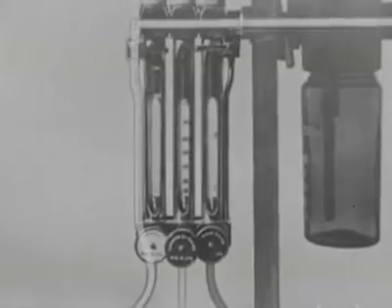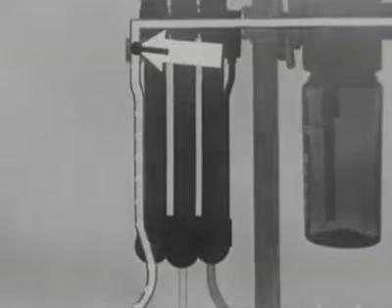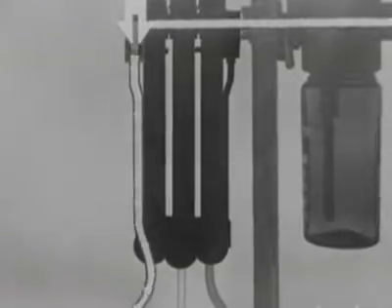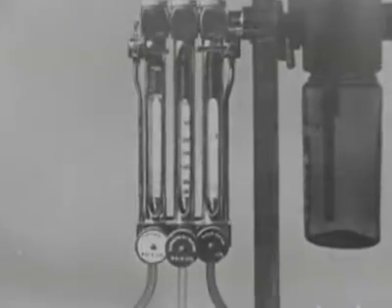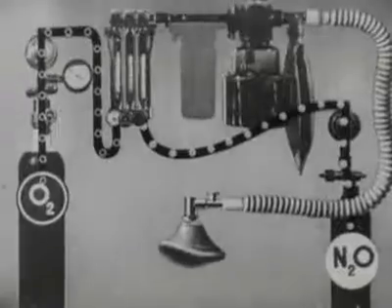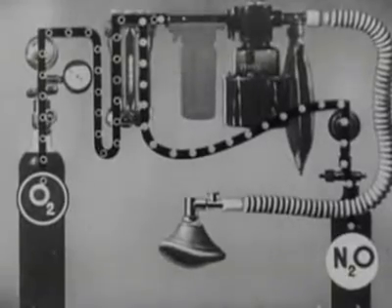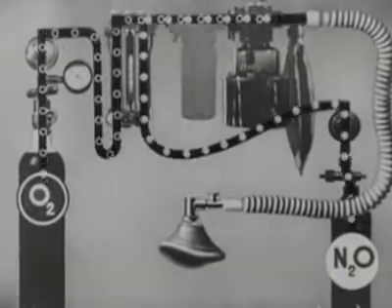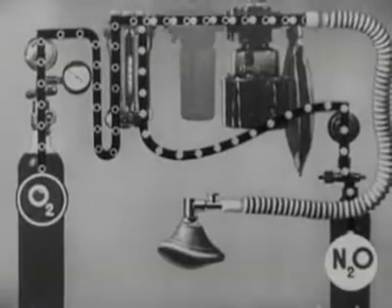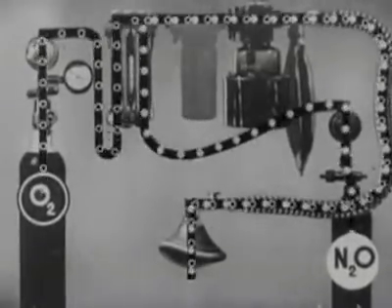The oxygen flow meter is fitted with a bypass. When the tap is turned on, large quantities of oxygen are delivered under pressure. After passing through the flow meters, the nitrous oxide and oxygen mix, flow past the ether bottle, past the rebreathing bag, through the corrugated rubber hose to the face mask.